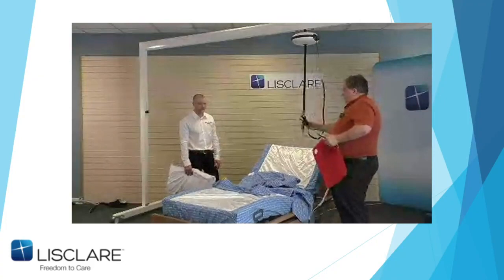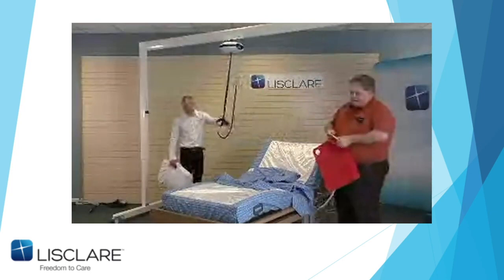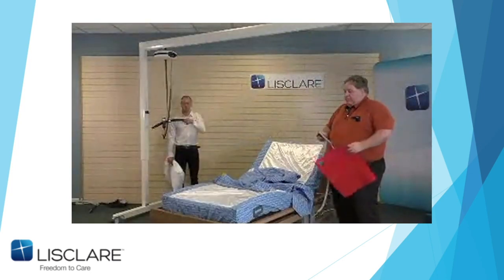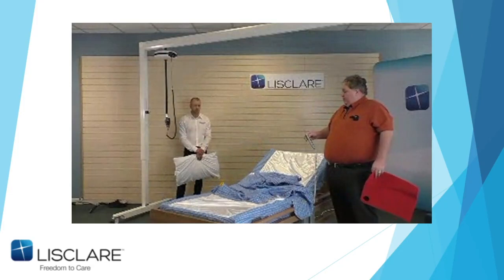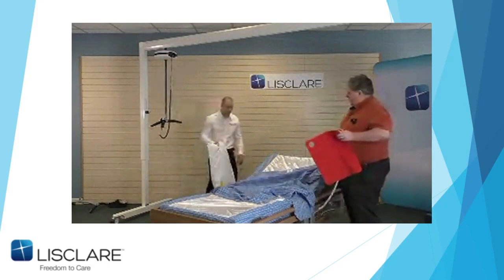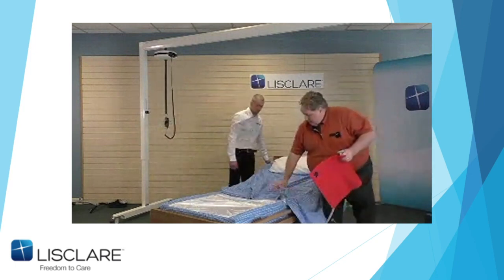There are different parts that we've missed out today, like getting in and out of the bed, because we just don't have the time, but I'll discuss that in a minute or two. When the patients are lowered onto this, they're usually set flat on the hoist.